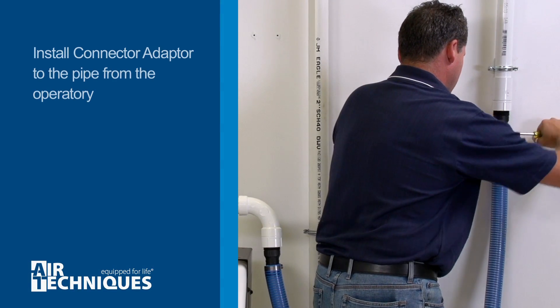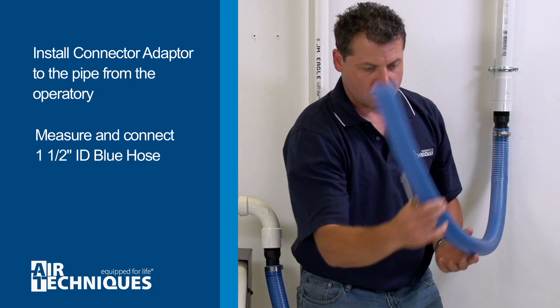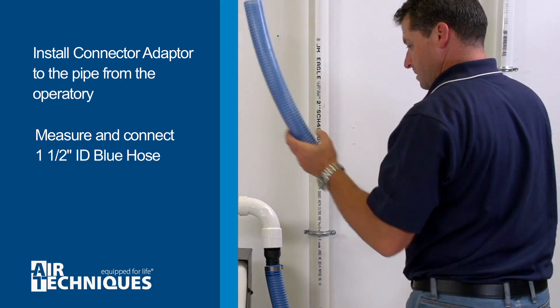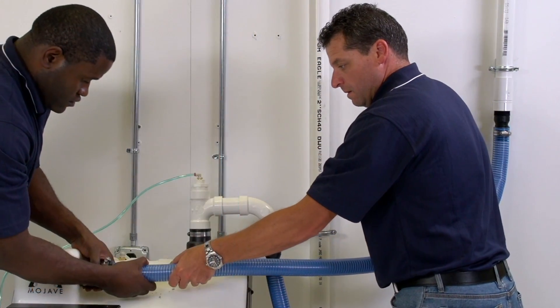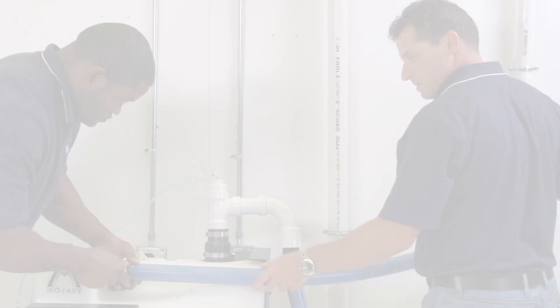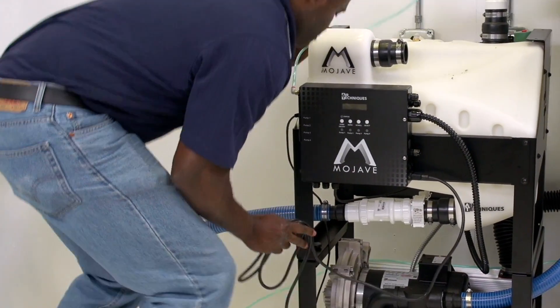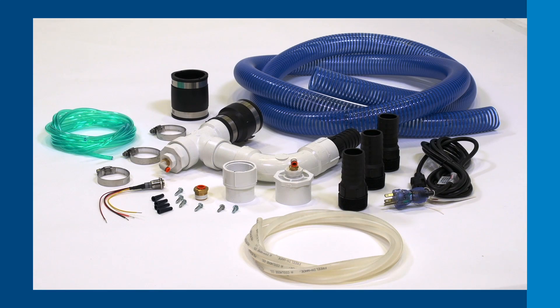Begin by installing one connector adapter to the pipe from the operatory. Measure and connect the 1½-inch ID blue hose cut for installation between the operatory suction line and tank inlet, and secure both ends with hose clamps. Meanwhile, the other installer can power the MMC by plugging in the IEC power cable to facility power. The IEC cable can be found within the tank accessory kit.